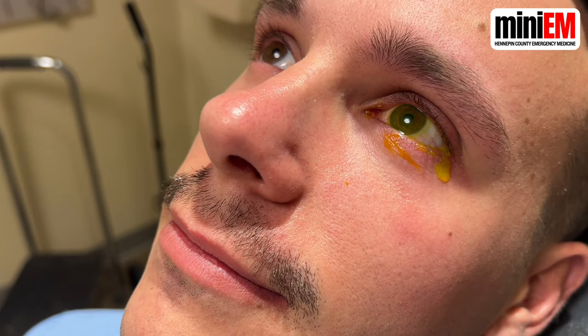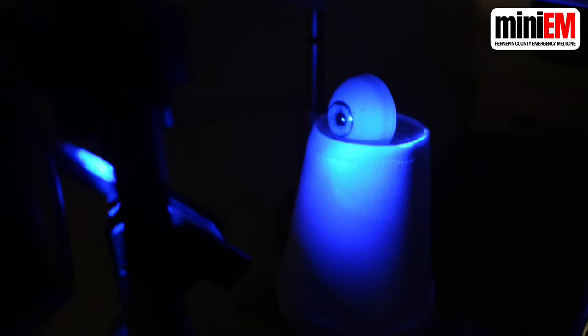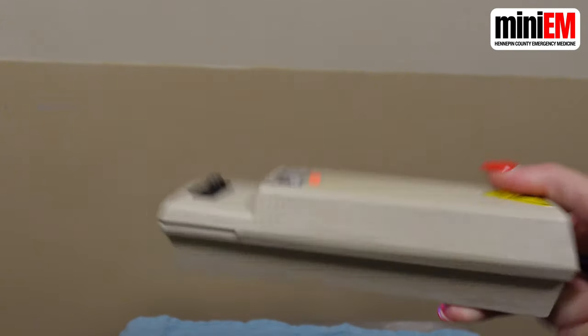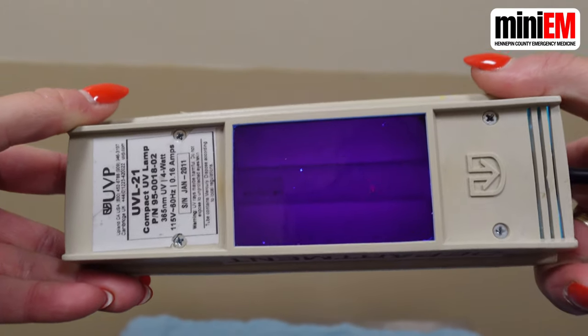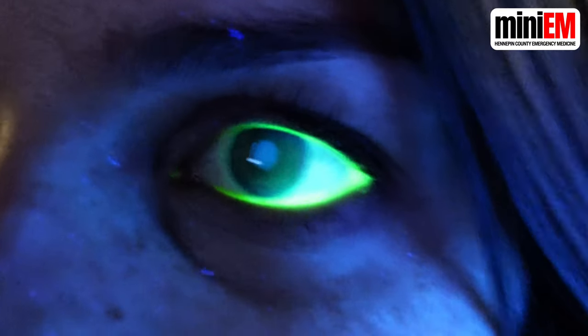Now turn the lights off and you can either use the blue light from a slit lamp or you can use a handheld blue light to make the dye fluoresce. If possible, it's most ideal to look at their eye under magnification with the slit lamp's blue light. Now examine their eye.